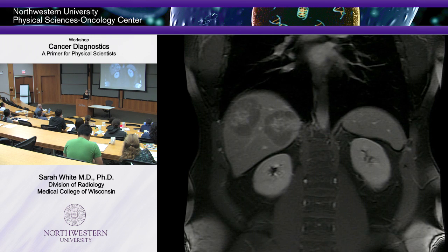This is an MRI. Okay, we can image in different planes. We don't have to just image in the axial plane. Here we're looking in the coronal plane, so if I cut you like this. Okay, so up top here, this is his heart. Okay, this is his liver, kidneys, spleen, and his spine.